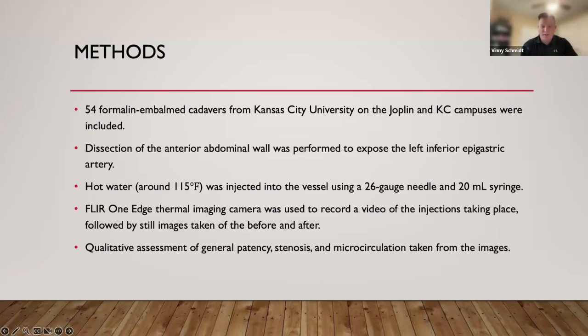its course, so the inferior epigastric artery, making sure it stayed open. You could usually see the walls and the margins of it. I made sure I tracked it all along the way, and I made sure to inject just distal to the inguinal ligament, and that's how I went about it, just so I had much more room to work with.